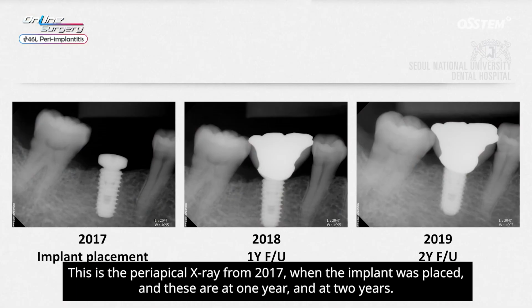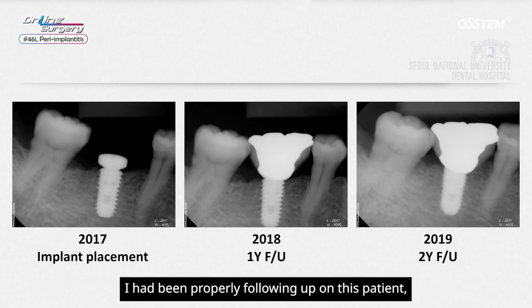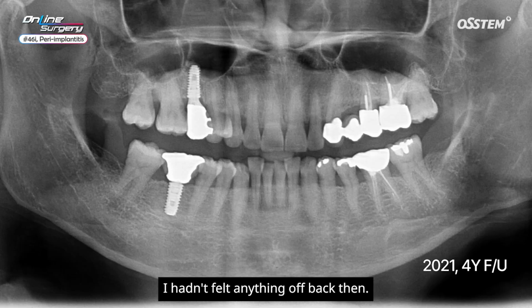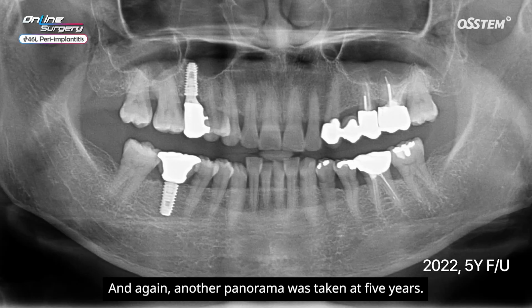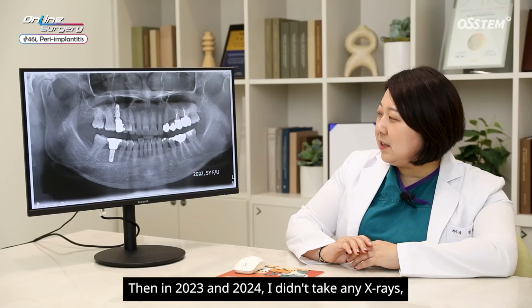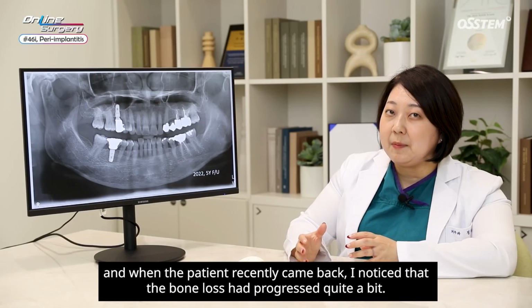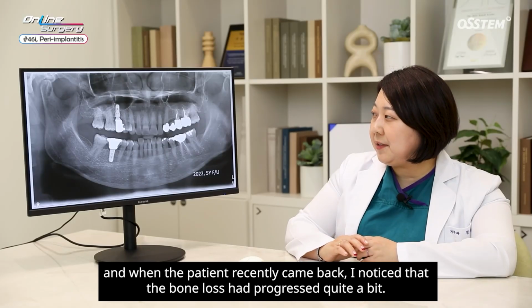This is the periapical x-ray from 2017 when the implant was placed, and these are at 1 year and at 2 years. I had been properly following up on this patient, but then 4 years later, I only took a panorama. I hadn't felt anything off back then. And again, another panorama was taken at 5 years. Then in 2023 and 2024, I didn't take any x-rays. And when the patient recently came back, I noticed that the bone loss had progressed quite a bit.